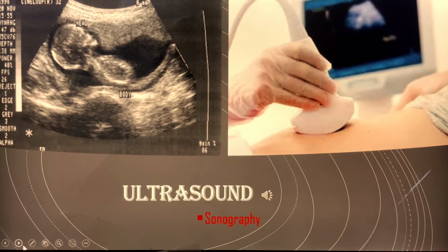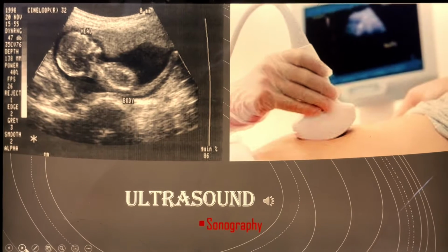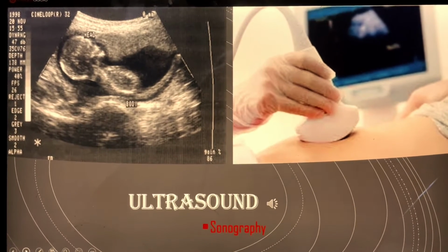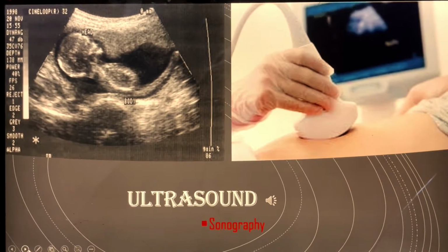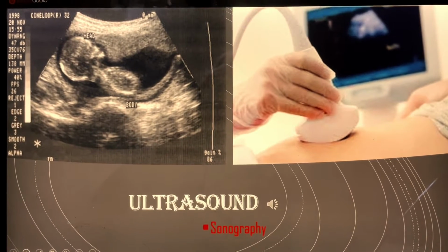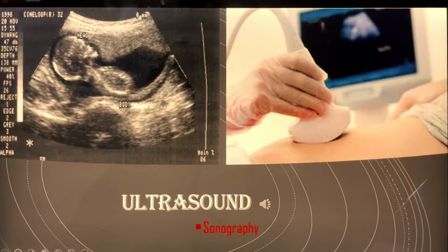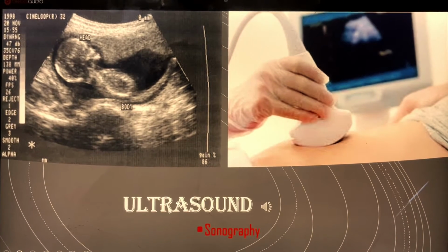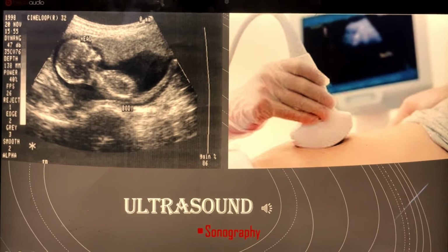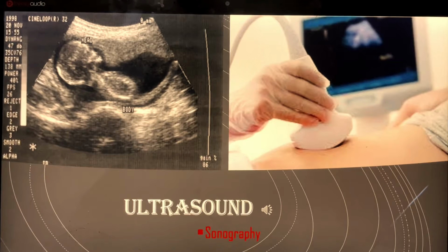Fun fact, ultrasound is safe to use. It's non-invasive, so that means it doesn't require any surgical equipment. It does not use ionizing radiation, which, what does ionizing mean again? It means particles or electromagnetic waves that carry significant energy that detaches electrons from atoms.